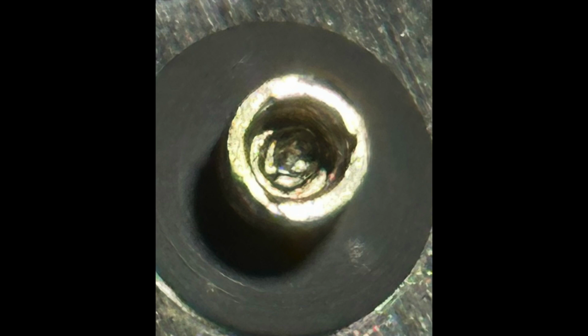And to remove an osseointegrated implant usually goes with a huge amount of bone loss, meaning we will have then to graft, to wait, replace the implant, wait for the healing, and so on and so on. So it's a huge time investment, which patients usually don't like. It's not only a matter of liking, but much more than that, it's a matter of losing trust. They don't trust us anymore once we get to this point.